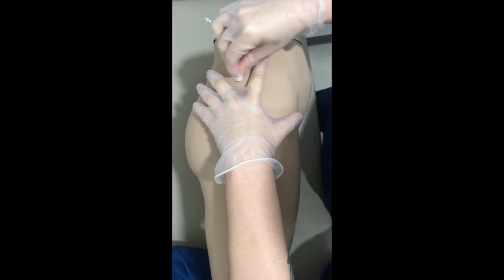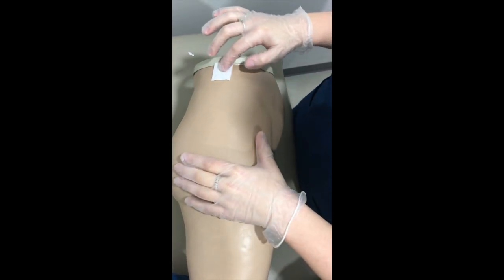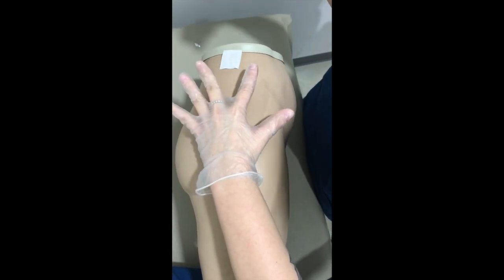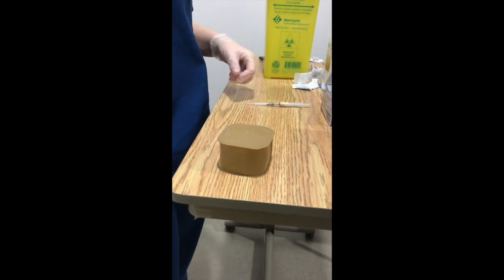We're going to start by cleaning again in a 2-inch circular motion starting at the center. And then we're just going to leave our little alcohol pad there so that we know to inject right below it, so that we're not keeping our hand there and risking stabbing ourselves in the fingers. So now we're going to do the intramuscular injection. Now that we have the site cleaned, we're going to be demonstrating it here.